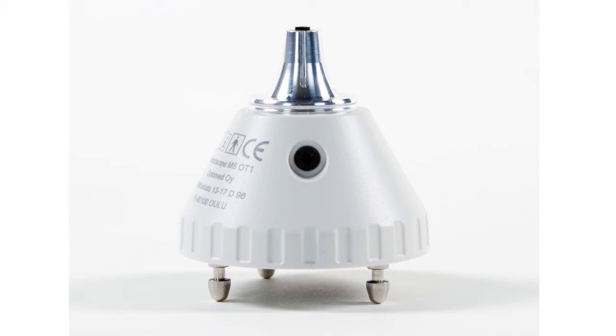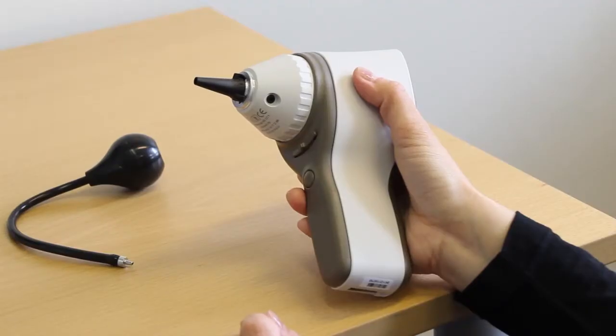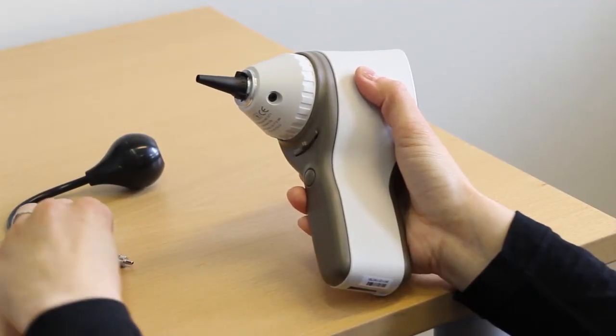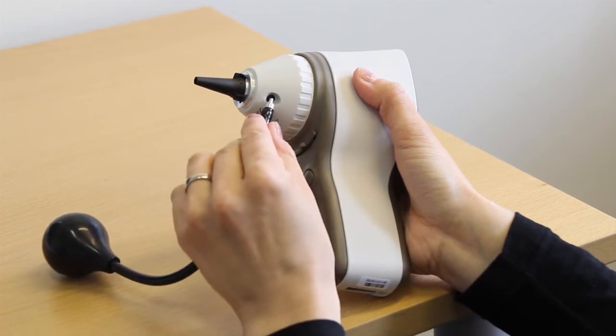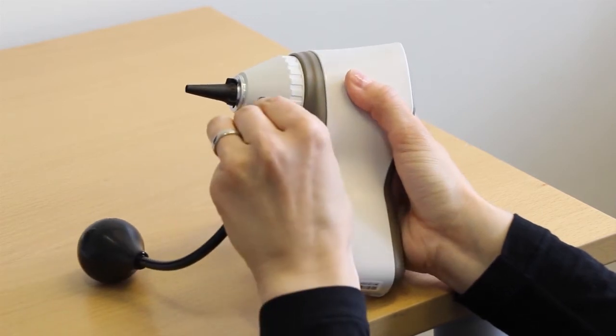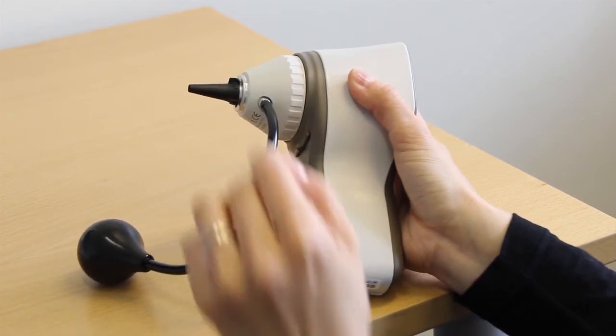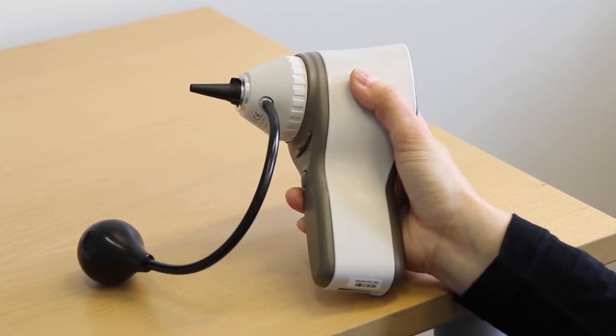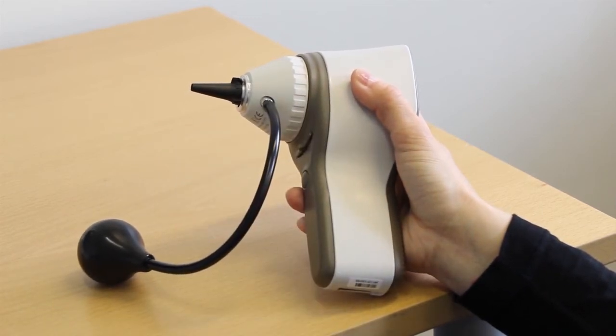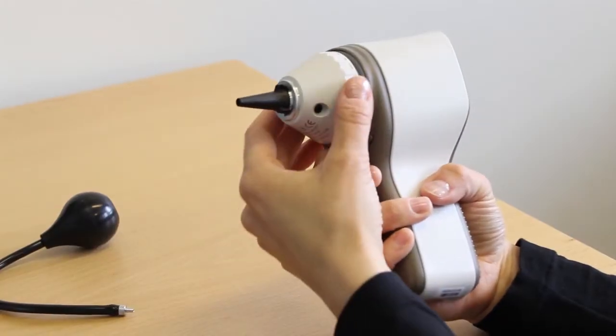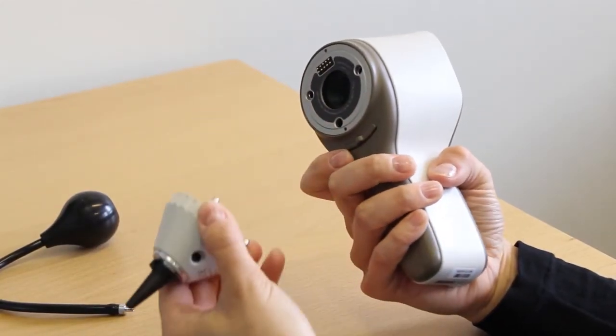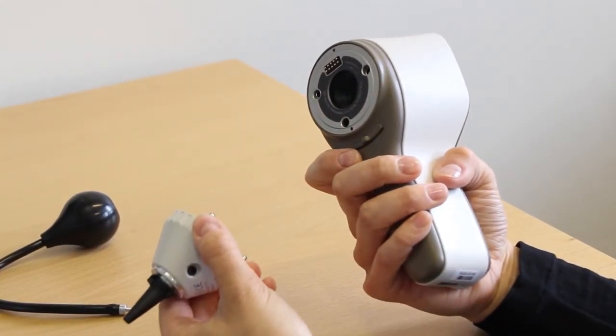An insufflation bulb is provided with the device in order to inspect eardrum movement. The bulb is attached to the vent located on the side of the optics module. Gently squeeze the bulb to create airflow in the ear canal. To detach the optics module, slide the release button.